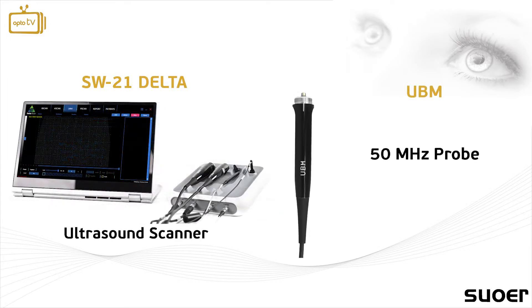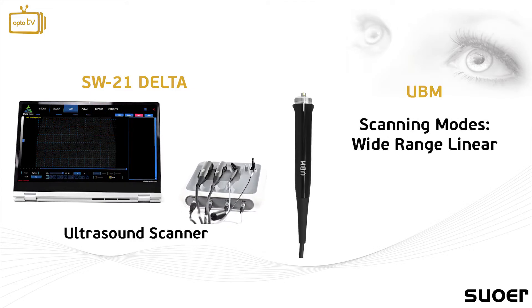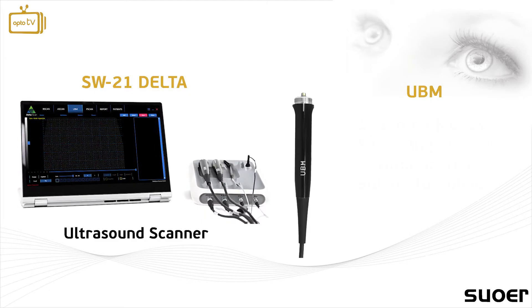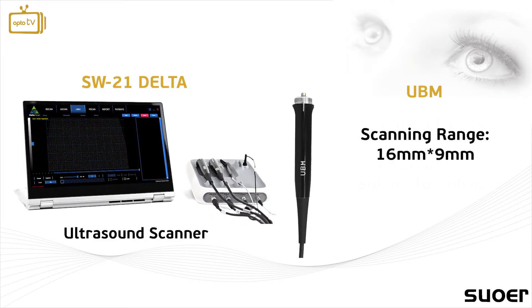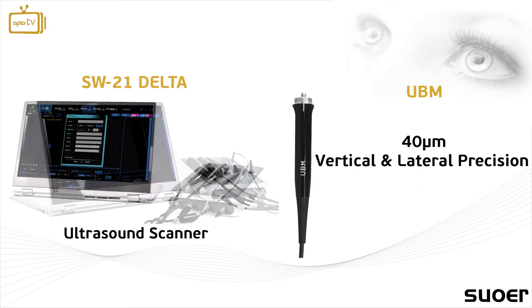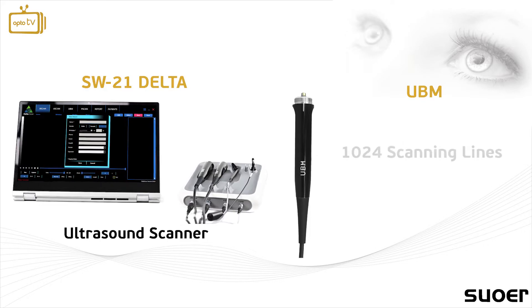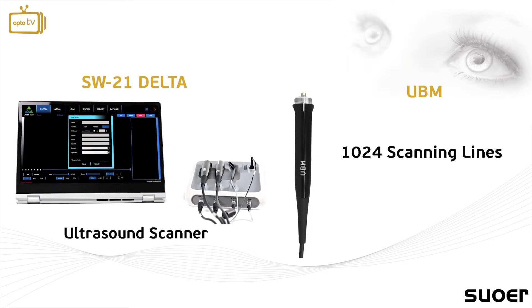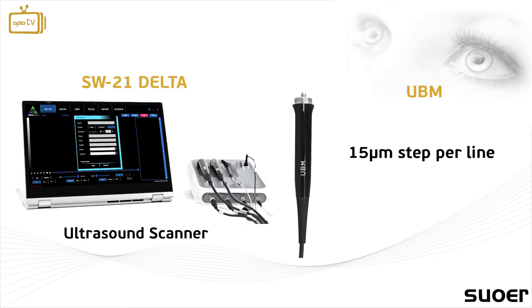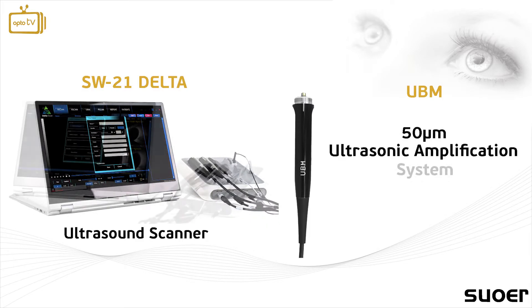The UBM probe has a 50 MHz frequency and allows the user to choose between the unique wide range linear, undistorted, and sulcus-to-sulcus scanning modes. It has a scanning range of 16×9 and 10×6.5 mm with 40 µm vertical and lateral precision. It offers one of the clearest images compared to other market examples, with 1,024 scanning lines, a 15 µm step between each line, and an independent 50 µm ultrasonic amplification system.